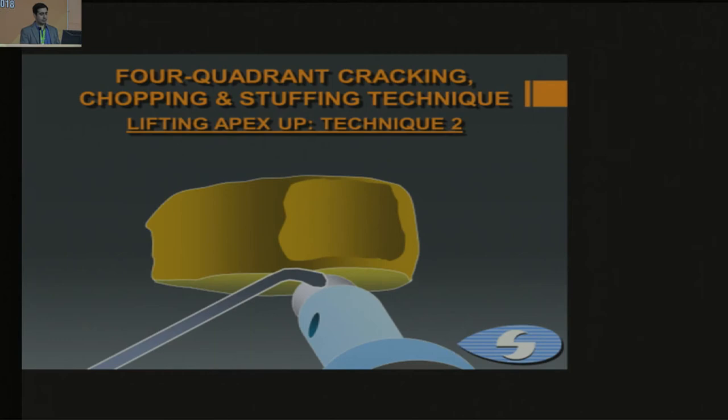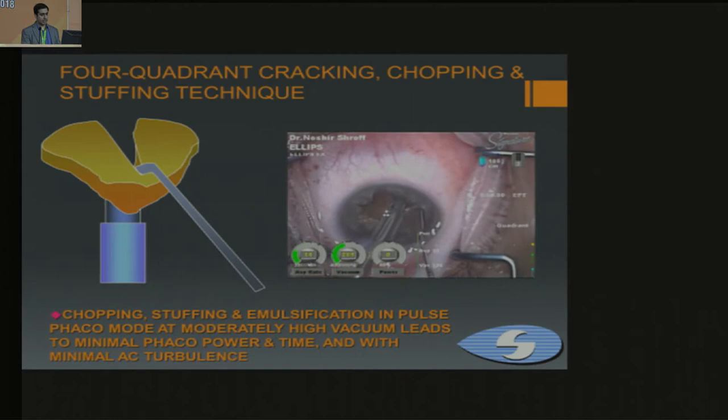This animation shows the same technique, and this was the last video demonstrating where each piece is pulled out of the rhexis margin and then emulsified.